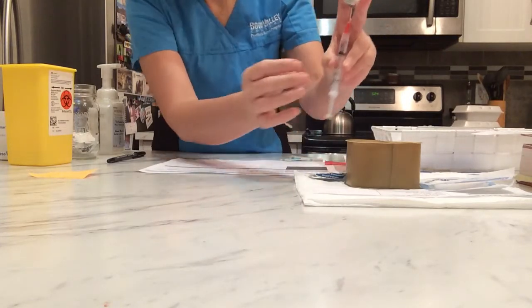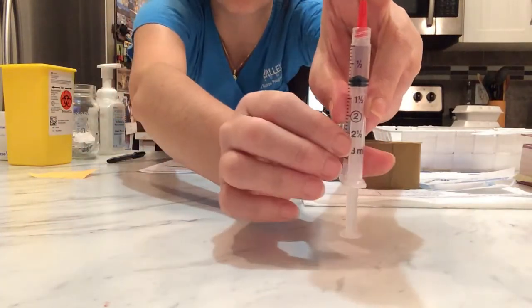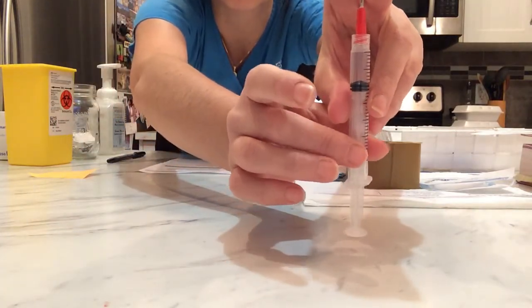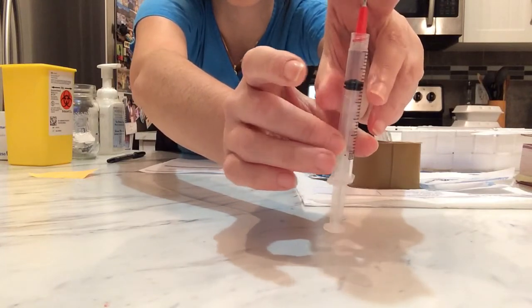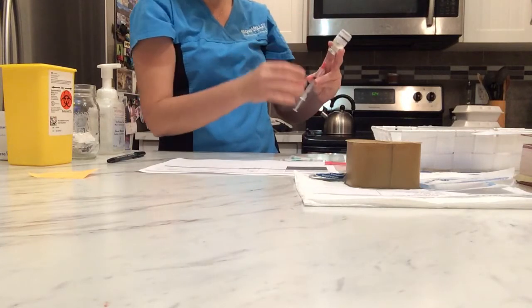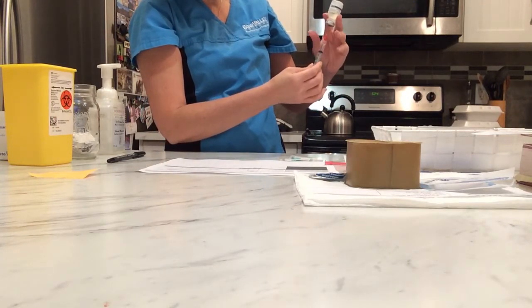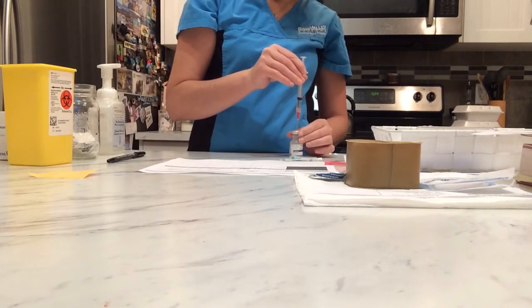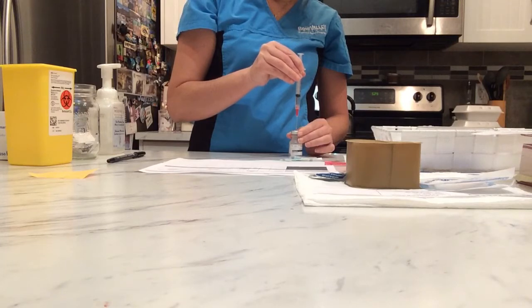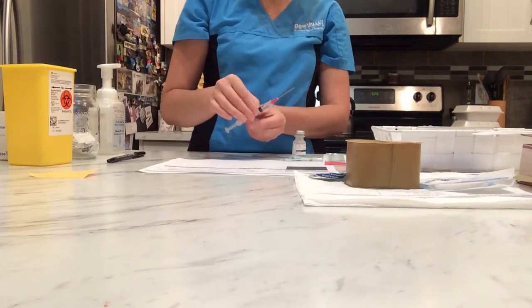Sorry. Just wanna make sure you can see no bubbles in there, but I will make sure when I change needles that I don't have any bubbles. Okay, so I have 1 mL. I'm gonna do the one hand scoop technique.